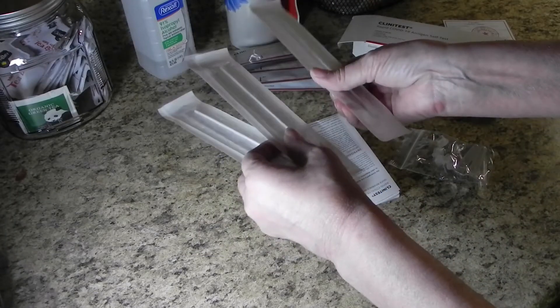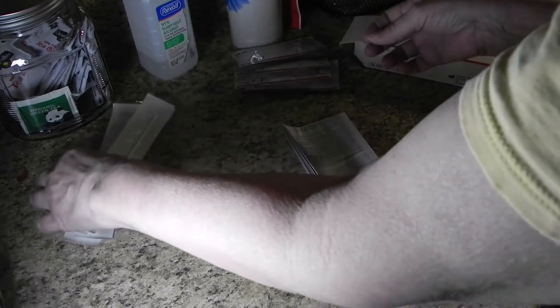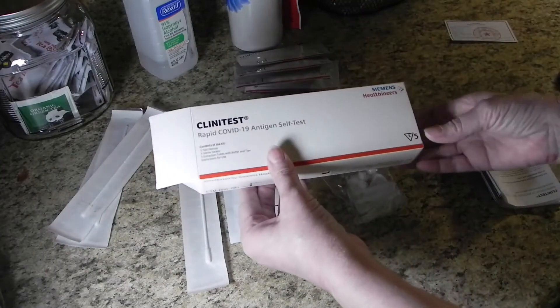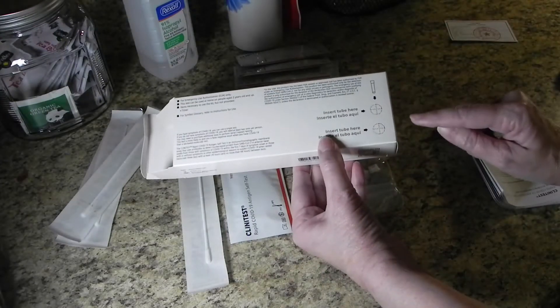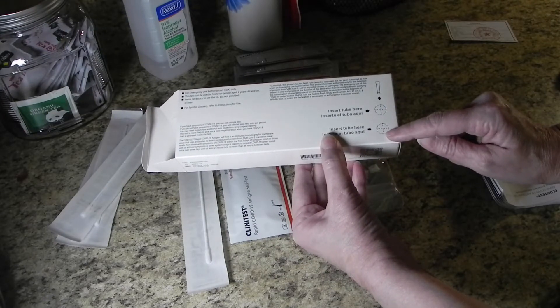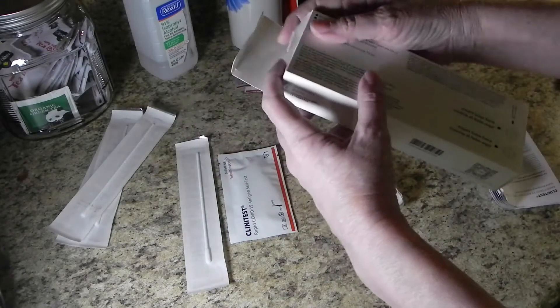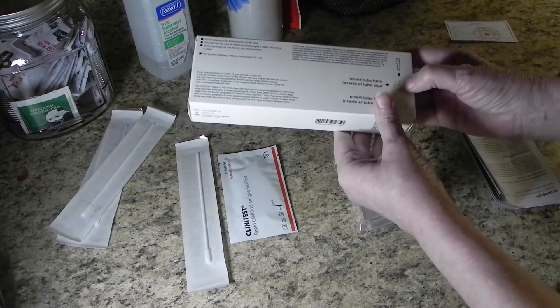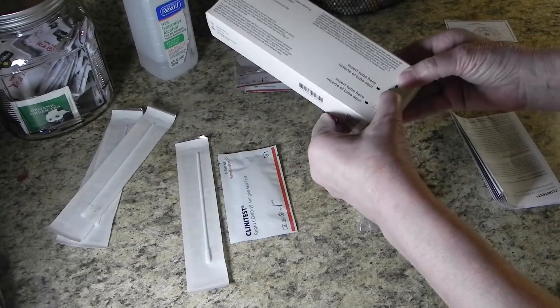Once you've ensured you have all your supplies, take out one Q-tip and one test cartridge. You'll also need your tubes. Look at your box — on the back there are two perforated spots to poke out, which you can use for holding the tester tube. Close the box and punch out one of those holes.